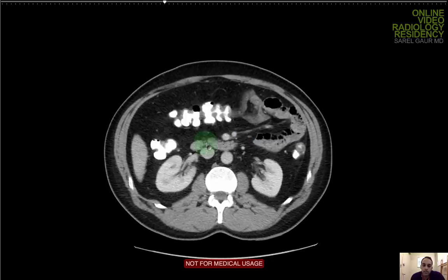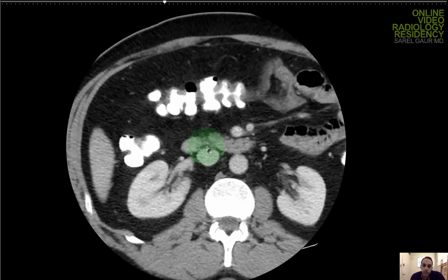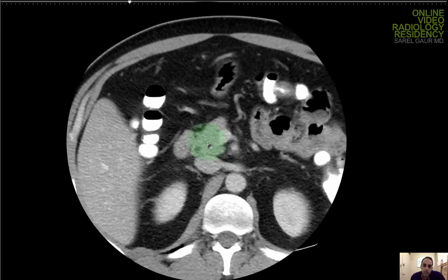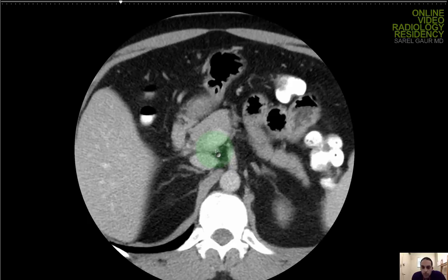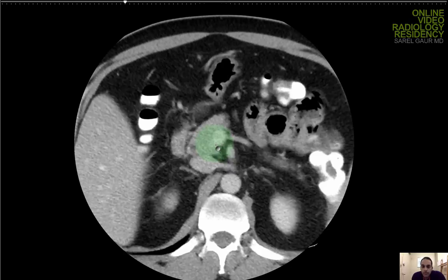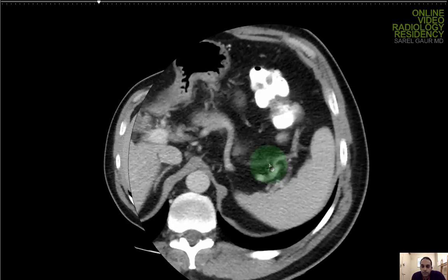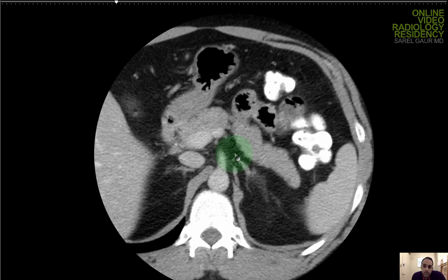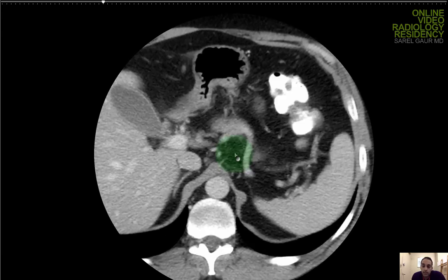Next I'm going to the pancreas. Starting at the third portion of the duodenum, coming up to the uncinate process, the head of the pancreas, and the common bile duct within the head. It curves right along the superior mesenteric vessels — the artery and vein. Then the neck, body, and tail. Looking for focal lesions, diffuse disease such as pancreatitis, or fluid collections. I'm not seeing any of that. The pancreas is unremarkable with no focal pancreatic lesions.